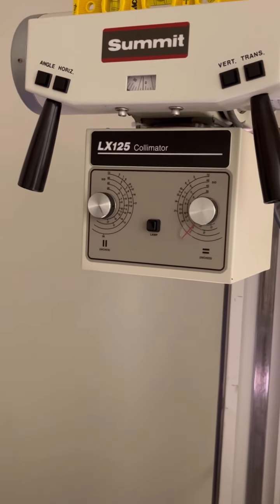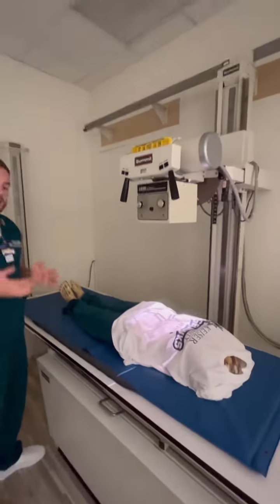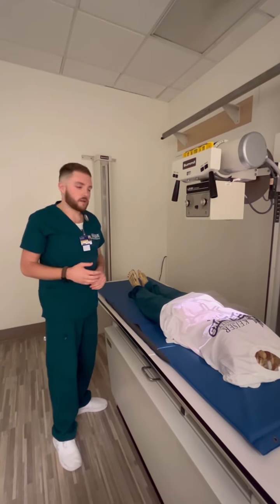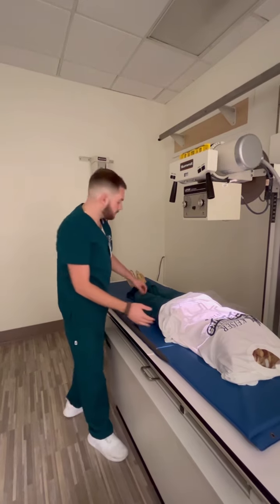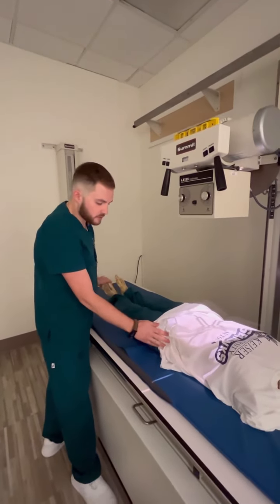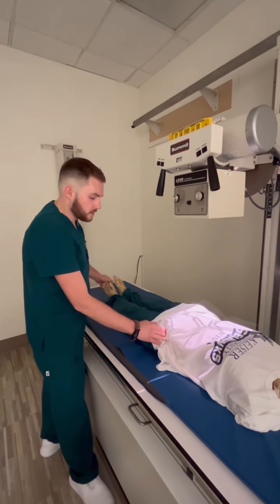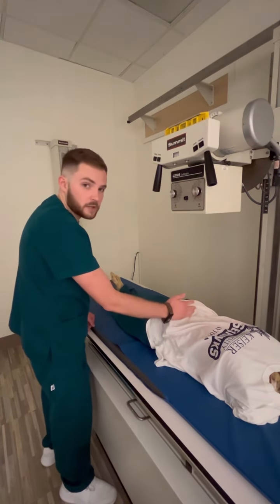So this is when I would tell the patient, hey, I'm going to start feeling on your leg a little bit just to find your trochanter and your pubic symphysis. Patient might not even know what that means, but I'm sure they'll be like, okay. So I'll grab the patient's foot and start wiggling it and feel for the trochanter. I feel it right here, so that means around that area is going to be my pubic symphysis. So about right here, then I'll ask them, okay, I'm just going to kind of press here.